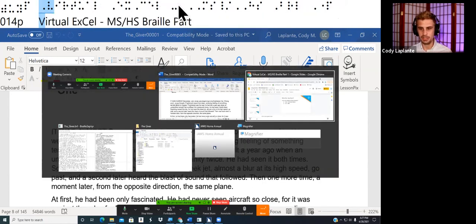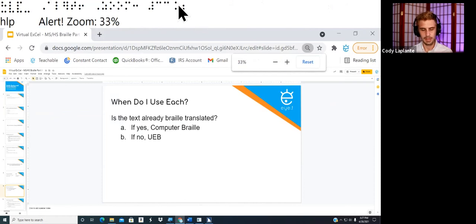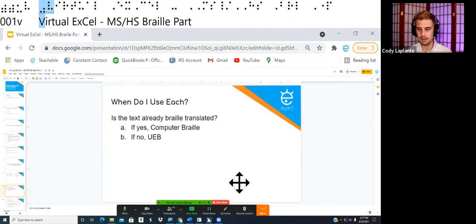Let's ask Virtual our question. Beautiful. So the question is, is this text already Braille translated? Is it already Braille translated? What do you guys think? Put in the chat what you think.